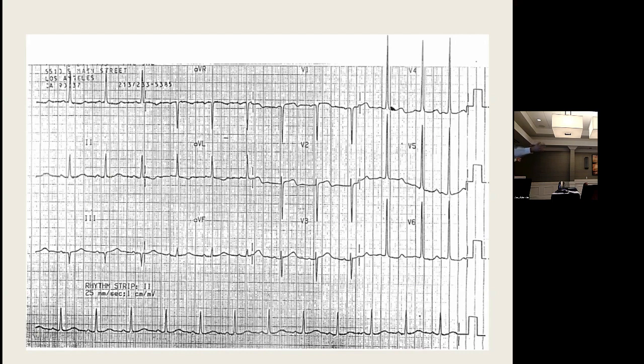But doesn't it make sense? V1, why would I have an S wave? V1 R wave points this way. S wave in V1 points behind me. You can see how the S in V1 is meaningful in suggesting that the left ventricle has concentrically hypertrophied. And if you can remember 35 and you measure from the baseline, this is minus 20. This is positive 30 already. Greater than 35 in patient age greater than 35. That 35 criteria only applies to adults age greater than 35. Children, you have to use age-matched criteria.